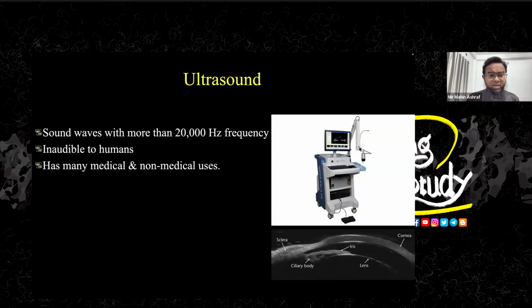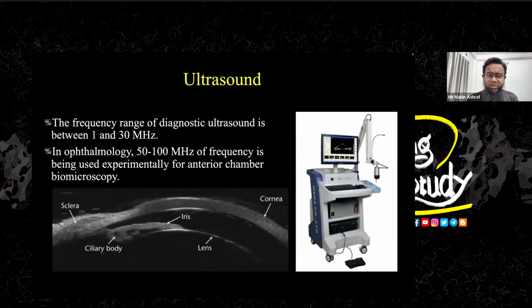So ultrasound is inaudible to the human ear. That's obvious, and we are not using 20,001, 20,002 hertz. Actually, we are using very high frequencies for our medical purpose. And for medical purpose, we are using 1 to 30 megahertz.